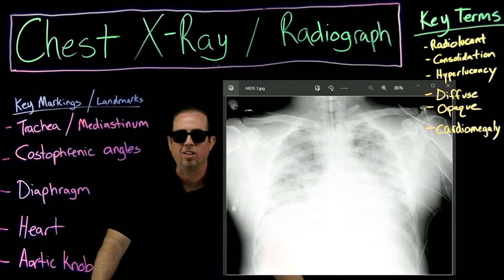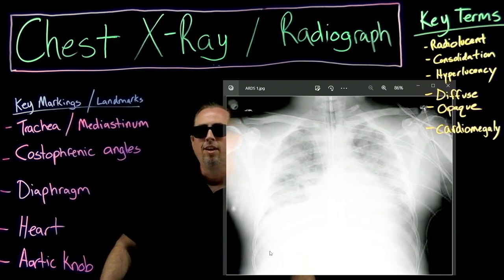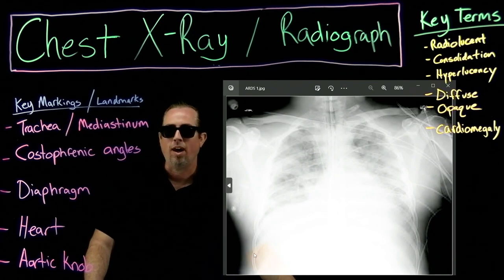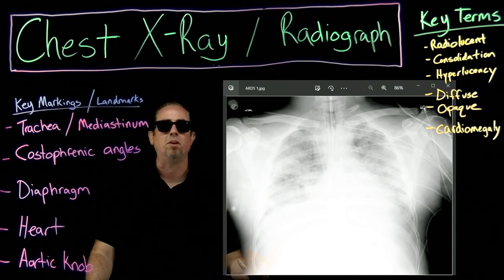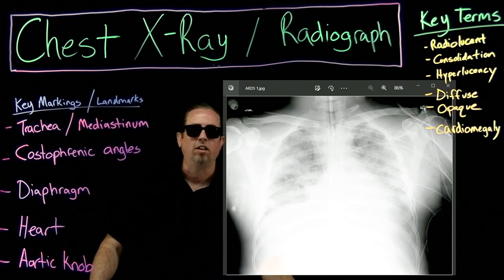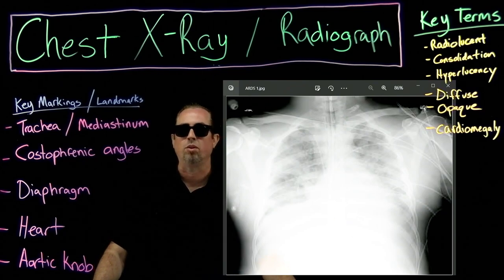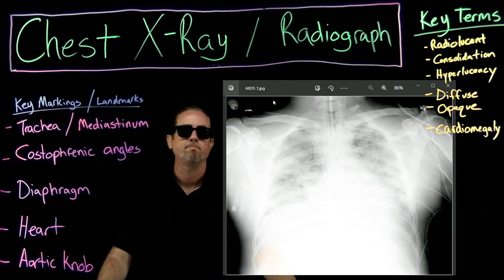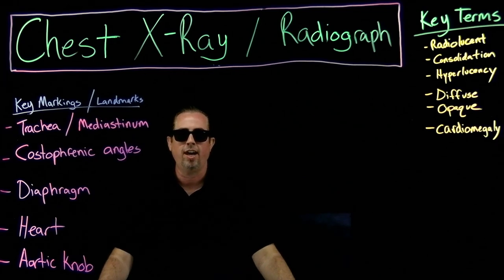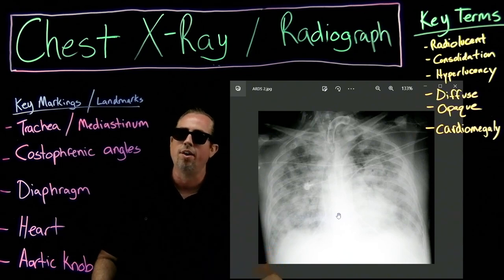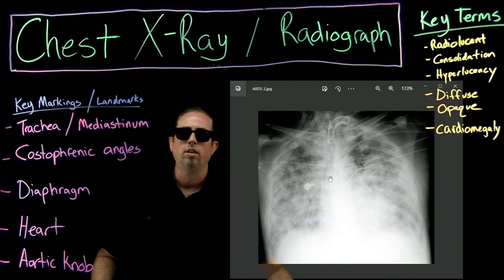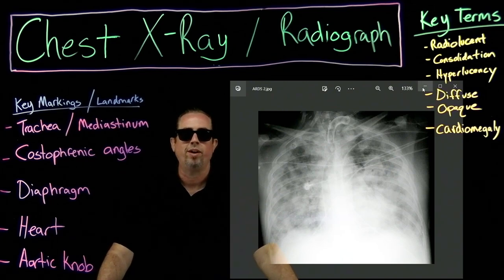ARDS — Acute Respiratory Distress Syndrome — shows major oxygenation and ventilation issues. You can see what we call a complete white-out. There's not much going on with this patient — you can't identify anything. All consolidation. This trach patient also has a tracheostomy tube in place — look at that consolidation. This is ARDS again, and you can see why there's a severe oxygenation issue.